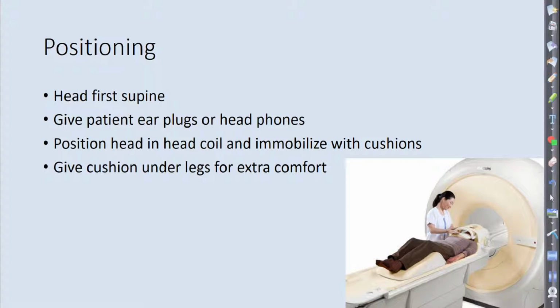Because even if they seem like, Jasmine, I have a feeling you can get through the scan in 30 minutes, but you're not going to realize how much you move your head around. So if they have those sponges right up against their head, they're less likely to move. And sometimes they have these things that push their head, so you can tighten it up so it reminds them not to move their head.